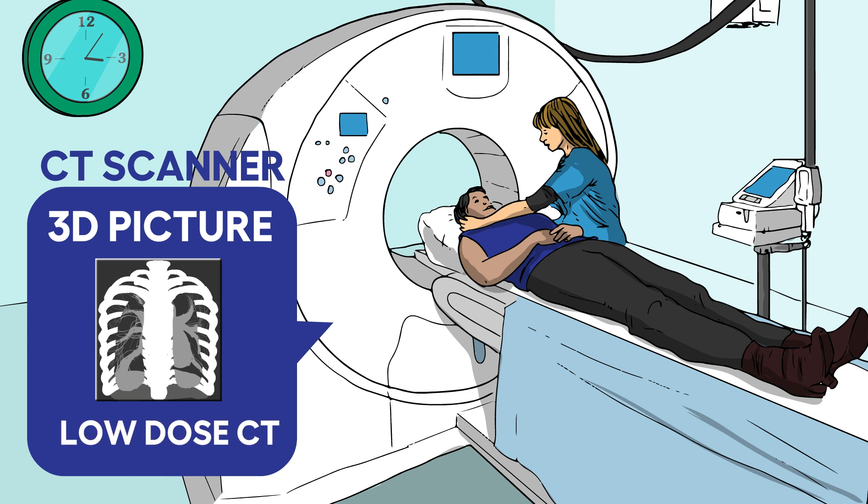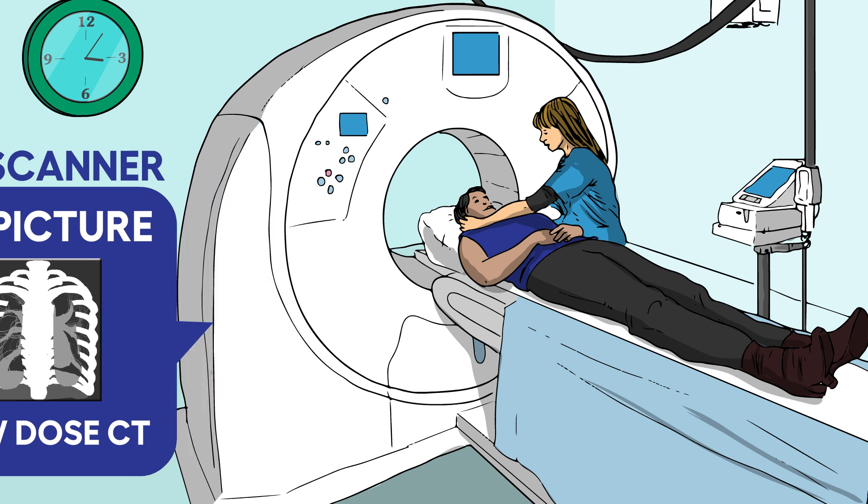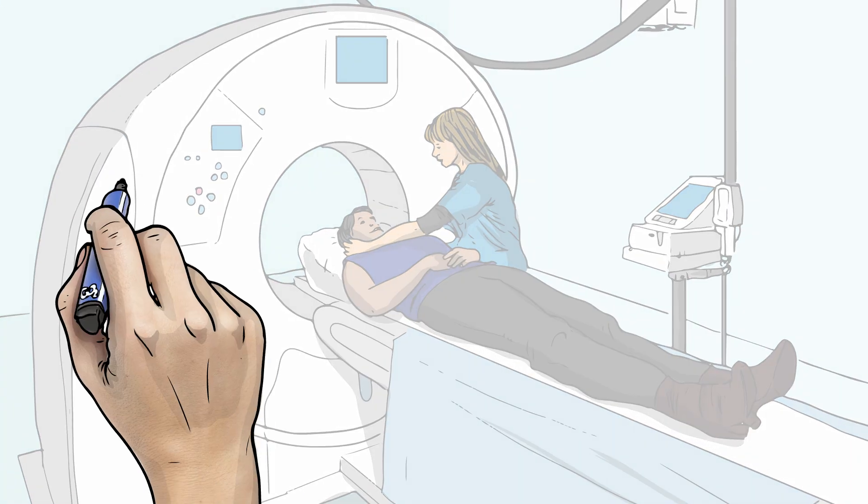Here's how it works. A machine called a CT scanner takes 3D x-ray pictures of your lungs using a small amount of radiation, also called low-dose CT. This level of radiation is a little more than a chest x-ray, but is much lower than other types of CT scans.